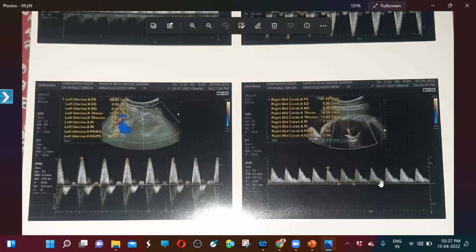It does not look like a high systolic velocity flow, because if it is abnormal, then there is a brain sparing effect. Those who have completed the color Doppler will understand me. Others may not understand me because this is a very lengthy discussion. You have to have a clear understanding of all the flows, which you will come to know when you complete the color Doppler. So it does not look like a brain sparing effect.